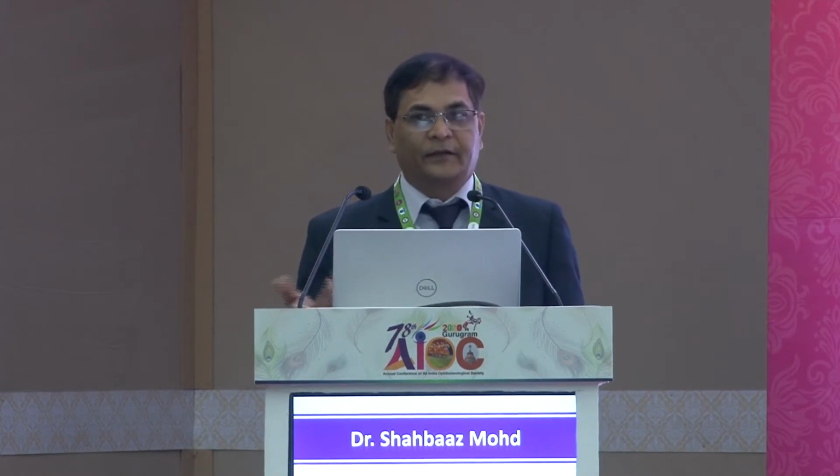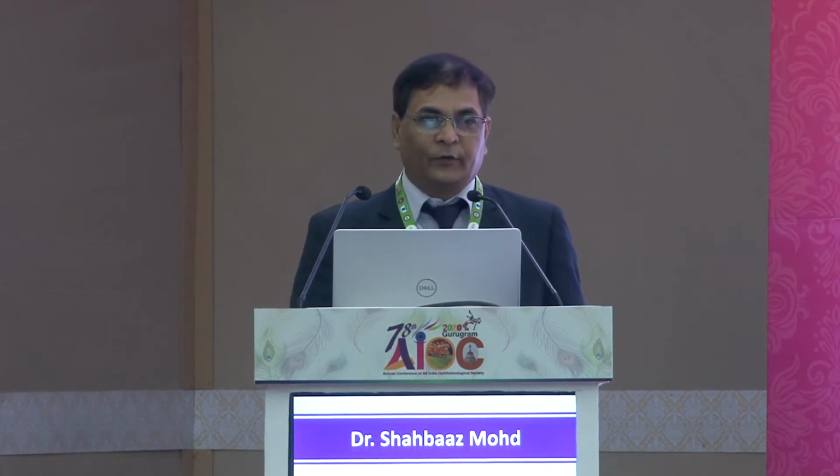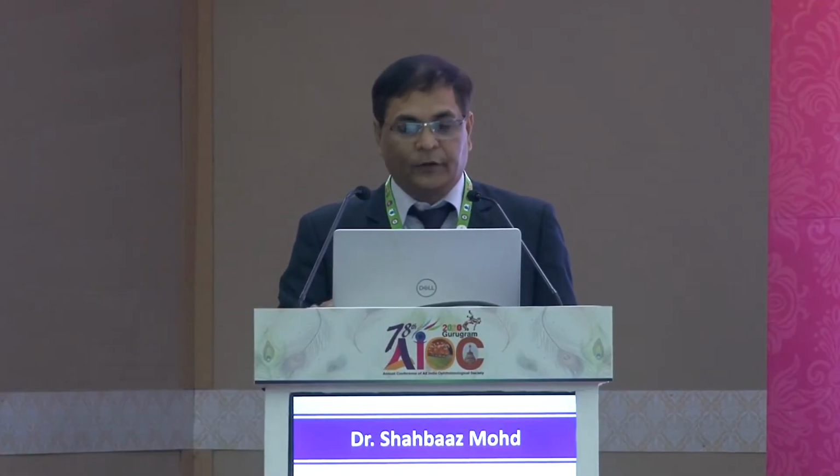Coming to the methods, we now have the optical method, which is the gold standard, but still in a lot of cases you cannot do optical, and cost is one of the factors, as not everybody can buy it. So now we come back to ultrasound. You have two methods: you can do applanation or you can do immersion. Immersion is superior to applanation. We'll go through that. So first, the basics of ultrasound.